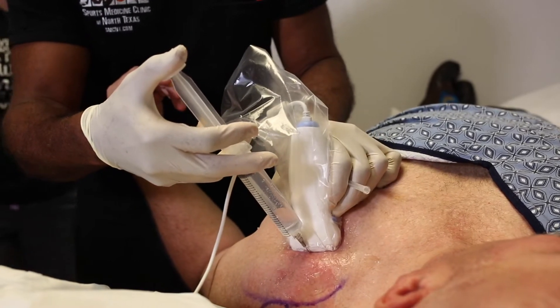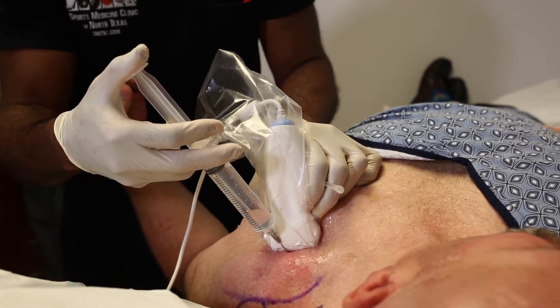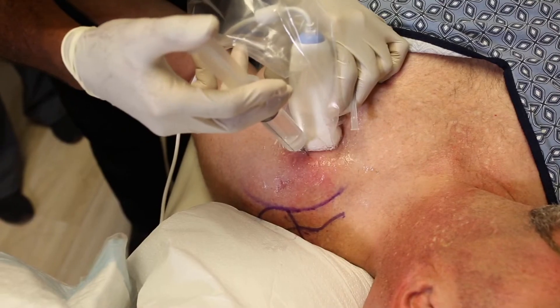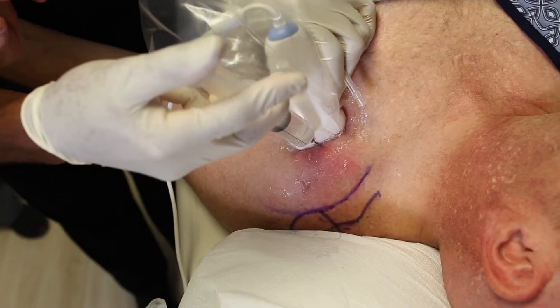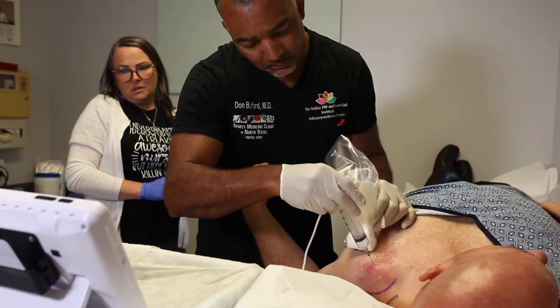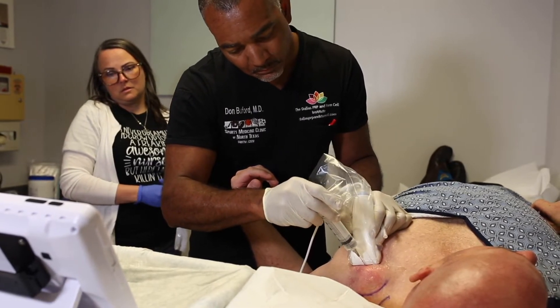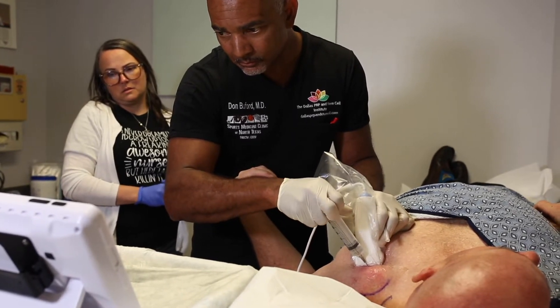Once we've hit the bone, we angle just slightly medial under ultrasound guidance. This becomes a field block where we flood the area where the suprascapular nerve is coursing with local anesthetic to complete this anterior suprascapular nerve block under ultrasound guidance. We found this is a very safe, very quick, reproducible way to provide significant anesthesia, especially for office-based arthroscopy procedures. We use this as a surgical adjunct as well, even when doing shoulder arthroscopy in the operating theater. As we complete the injection, we can ensure with ultrasound that we are medial to the coracoid with our injectate.